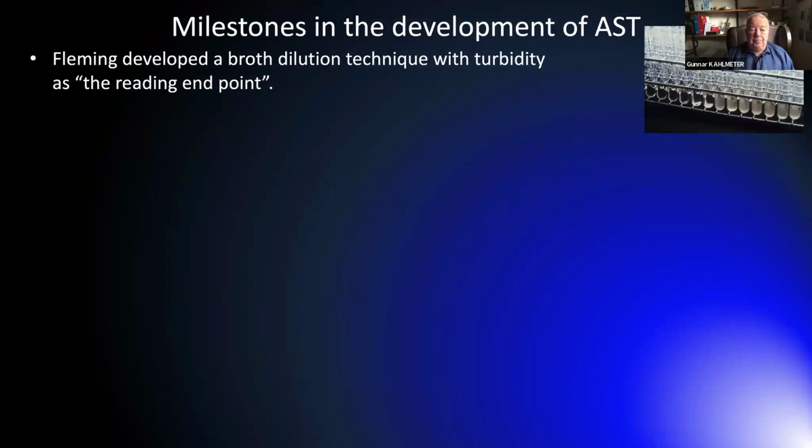Already Fleming developed a broth dilution technique with turbidity as the reading endpoint. And apart from the fact that we have made sure that this can be done in a micro broth format rather than in a format with all the big vials, it's basically the same method we're using today. It's probably better standardized today than it used to be, but basically it's the same method.